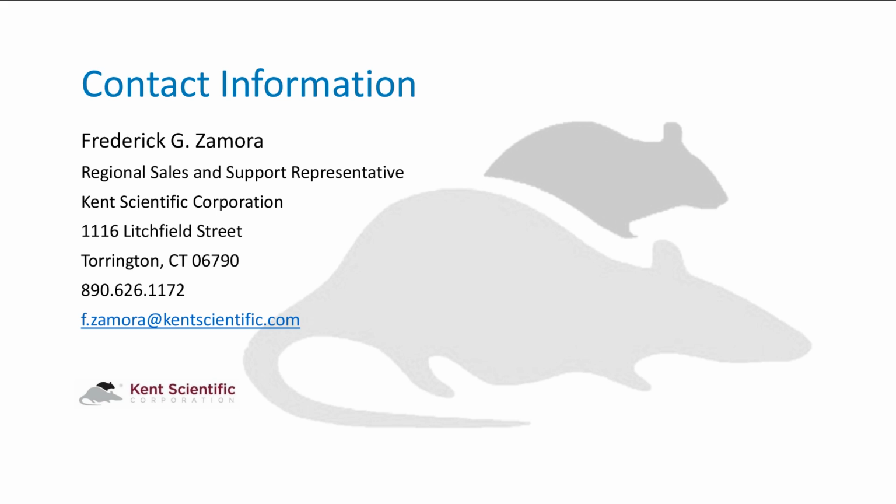The last question that we have here is, what is the flow rate of oxygen or ambient gas that needs to be used with the system? What is the flow rate of oxygen or ambient air?